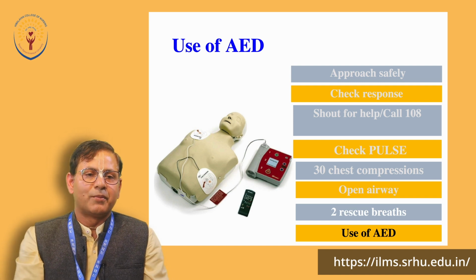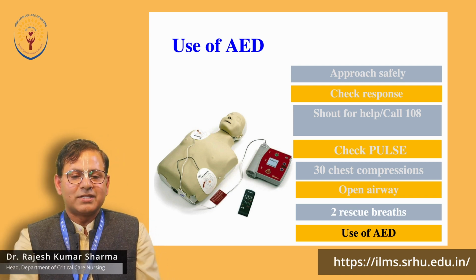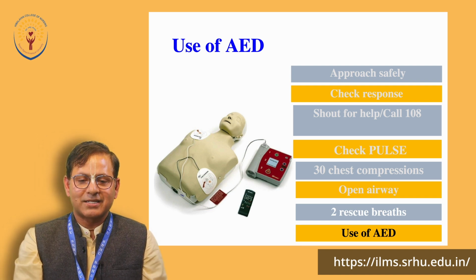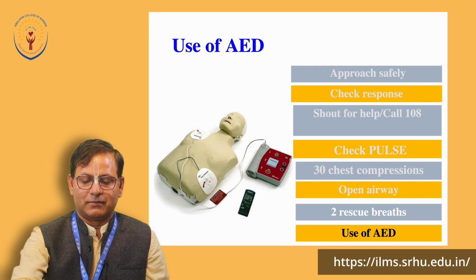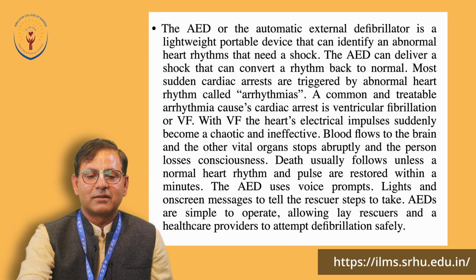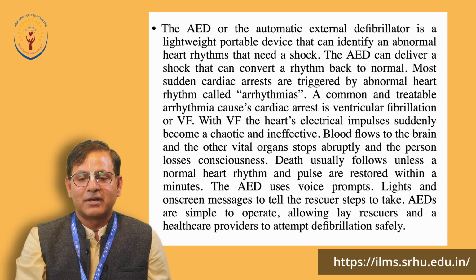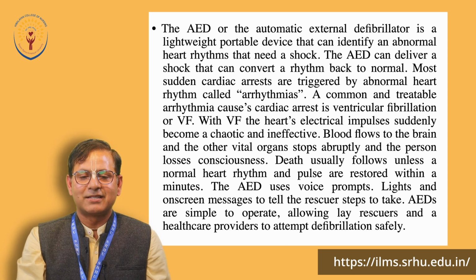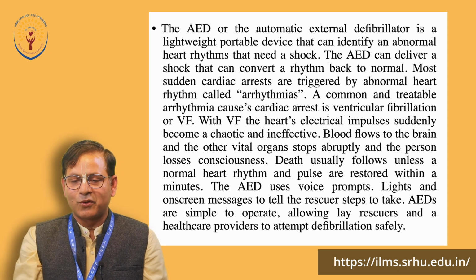So, this is how we maintain the airway, and now we will see how to use the AED. AED is an automatic external defibrillator. An automatic external defibrillator is a lightweight portable device that can identify an abnormal heart rhythm that needs a shock. The AED can deliver a shock that can convert a rhythm back to normal.